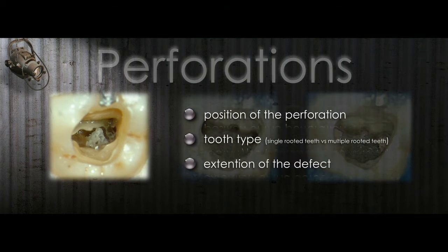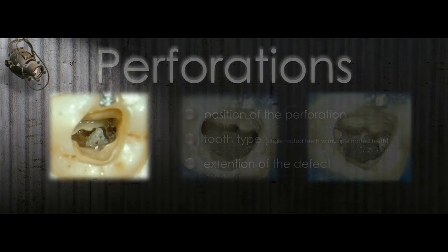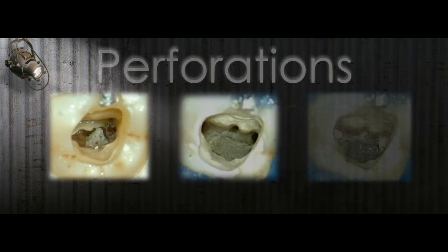First, the position of the perforation, the tooth type, whether we are talking about single-rooted teeth or multiple-rooted teeth, and the extension of the defect. All this must be understood exactly before our intervention.